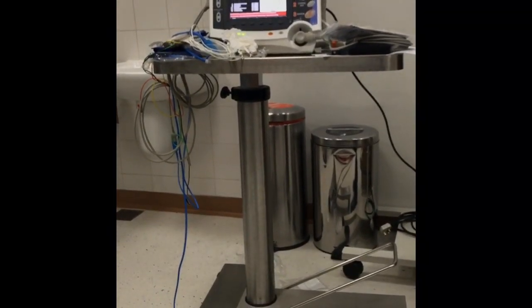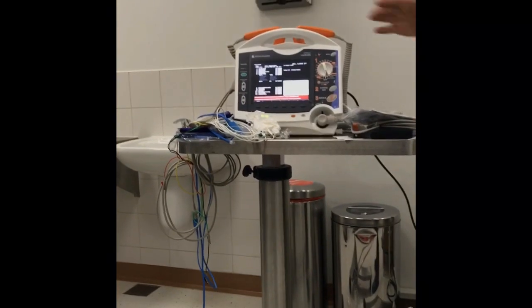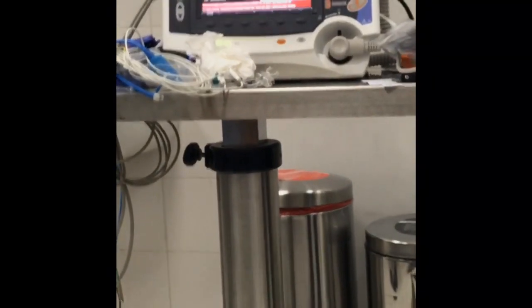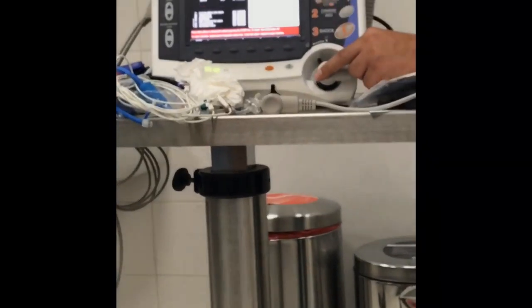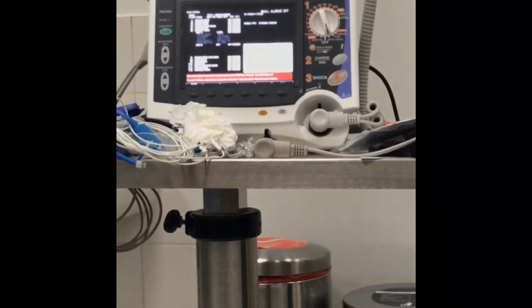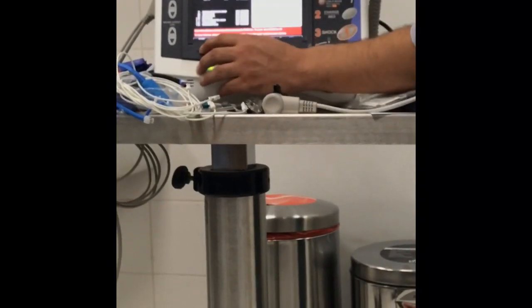So take this one out, connect the paddle. I have to answer all these questions here. It's easy. With time, you will learn how to do it fast. Then press start. We are not providing an SD card to this machine. The SD card slot is free, so no need to check the SD card. The first question, always skip it. So I will press skip.